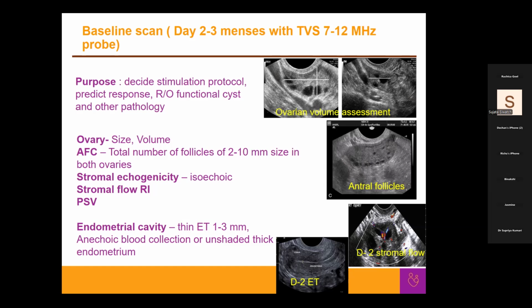Plus, another important thing is patient confidence and rapport building. You do the ultrasound yourself, you check the follicular growth, you look at the patient's uterus and endometrium. Your way of assessment can never match the radiologist's. So ideally, as far as possible, you should do it yourself. But if it is not possible, you can call your patient to the radiologist's center and join the radiologist to see how the growth is. This could be another way.